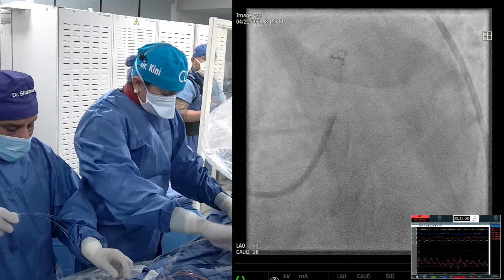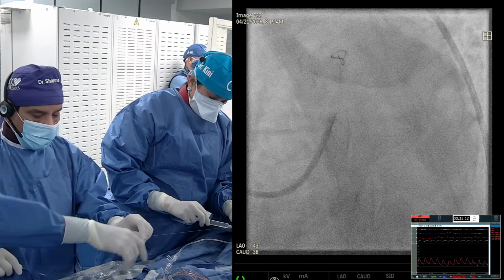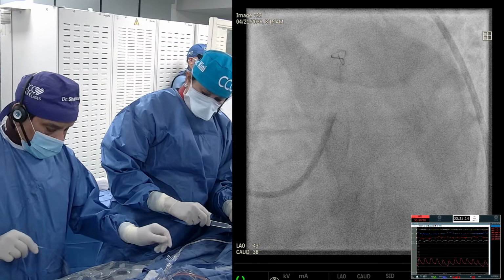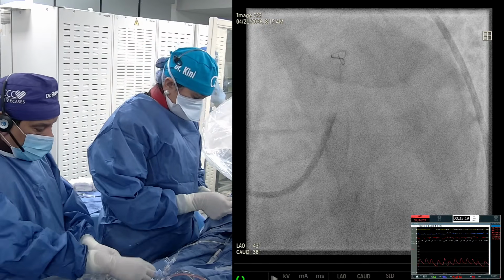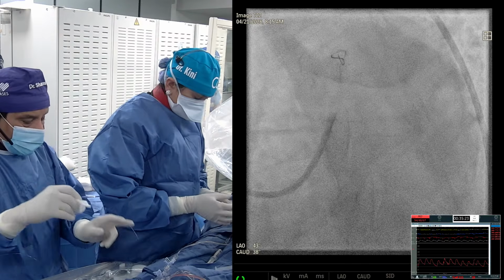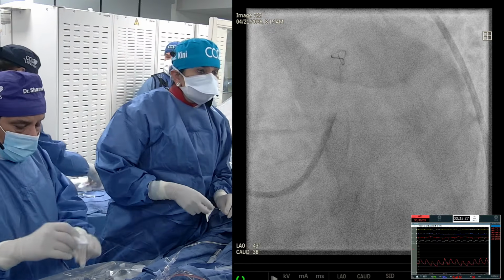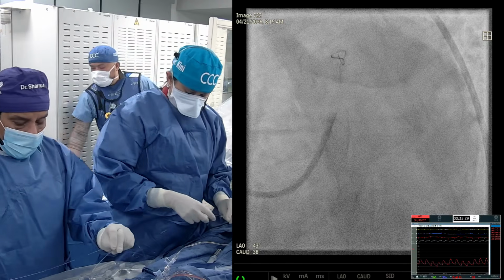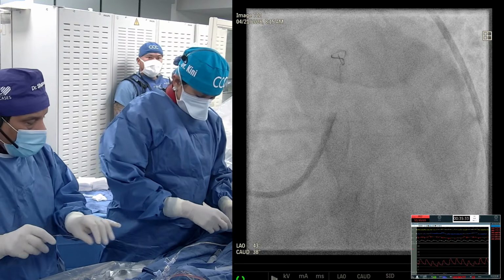But using a guideliner or any other device, particularly covering the main vessel, because you cannot do the Rota with the side branch, so you can put that in the side branch and do Rota of the main, but it will require an 8 French guide, which is very difficult. I mean, vascular complications may go up, but more importantly, many labs don't have the 8 French guide, and definitely don't have the 9 French.